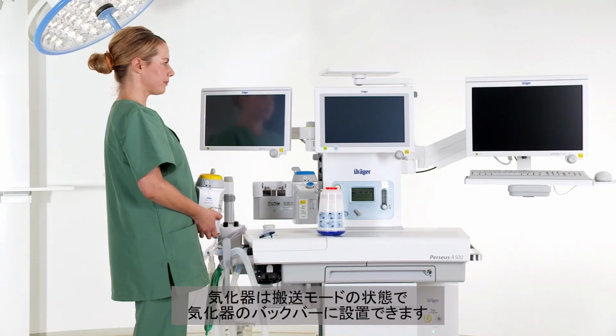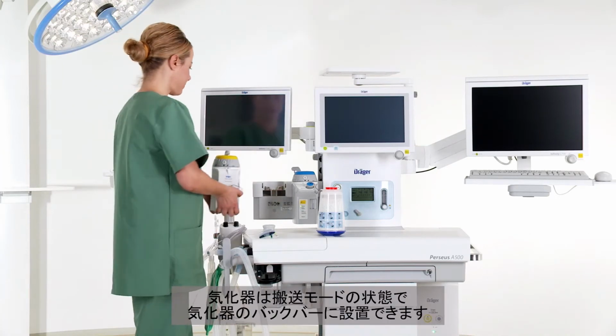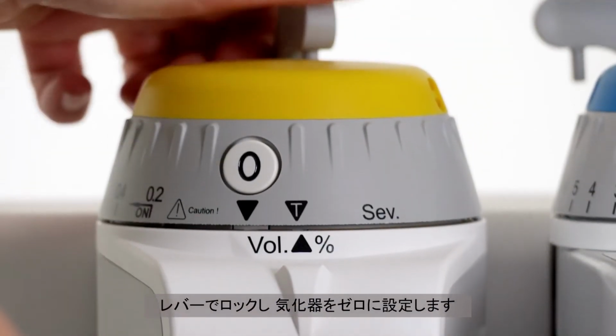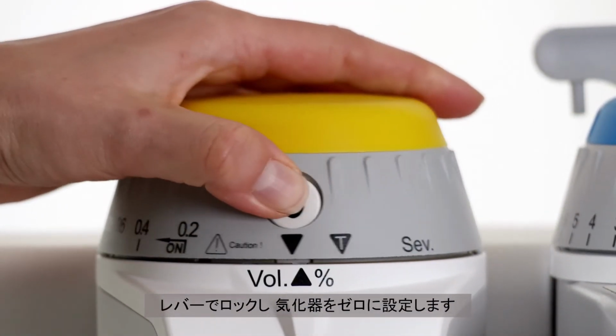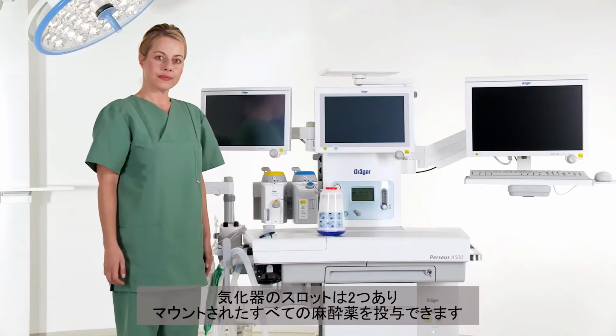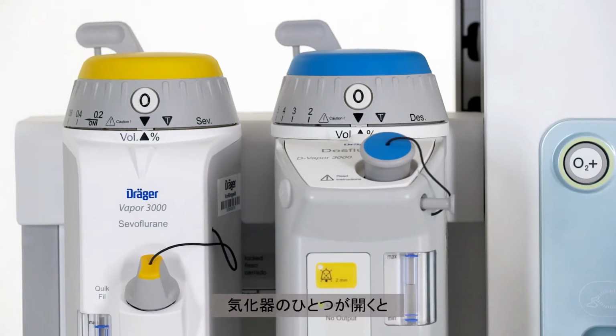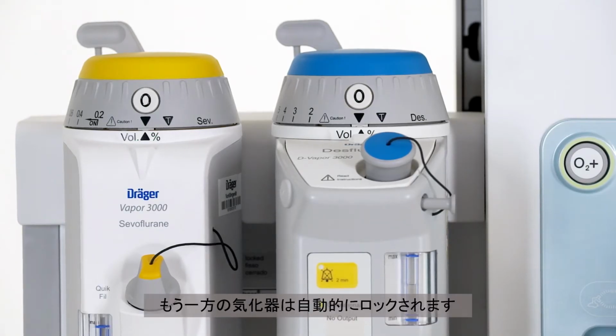The vaporizer is in transport mode and can be placed on the vaporizer back bar. Use the lever to lock it and set the vaporizer to 0. There are 2 vaporizer slots allowing the application of all currently used anaesthetic agents. Once one of the vaporizers is open, the other vaporizer will be locked automatically.